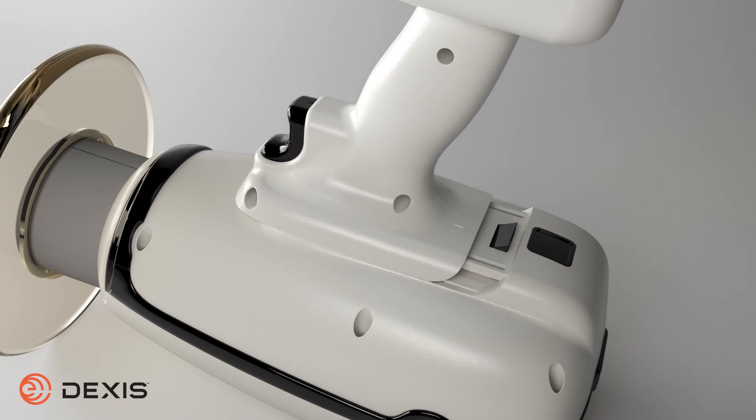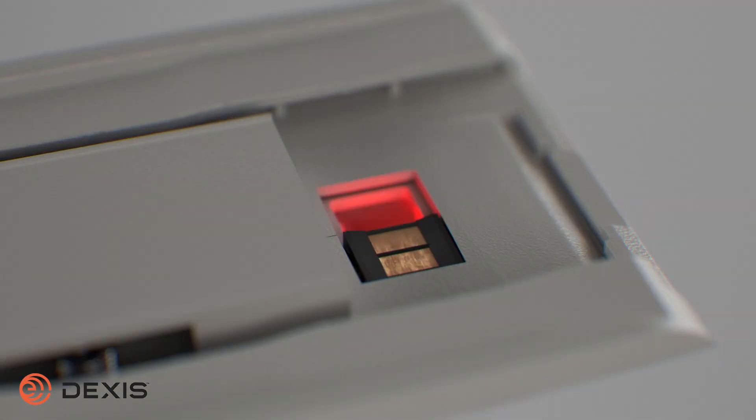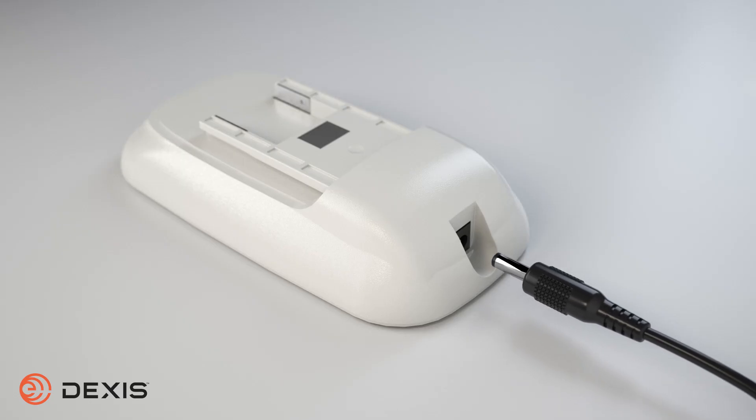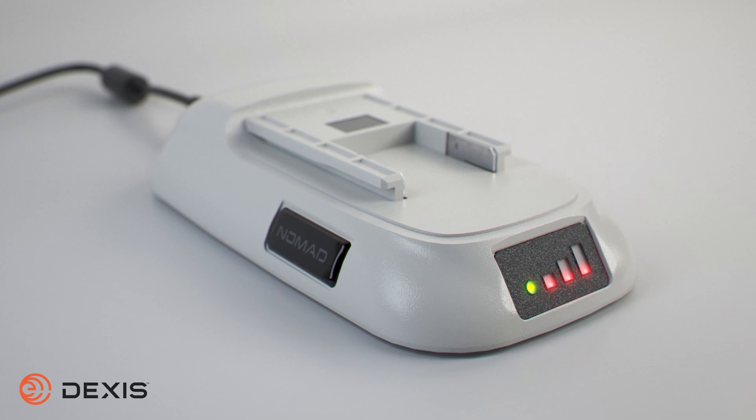To determine the charge level of your rechargeable handset, your handset must not be connected to your Nomad unit. While looking at the top of the handset, squeeze and hold the trigger. It is recommended to plug in the charging cradle away from the patient environment. When plugging in the charging cradle, the bars will flash red three times and the green circle will illuminate when the charging cradle is receiving power.